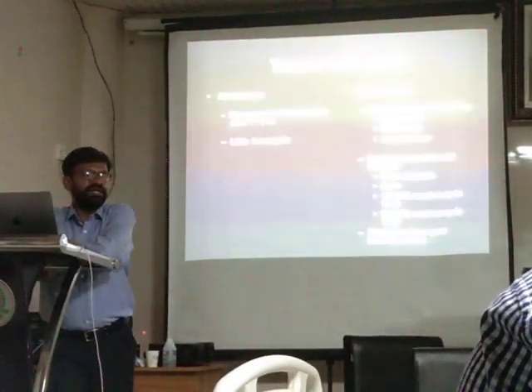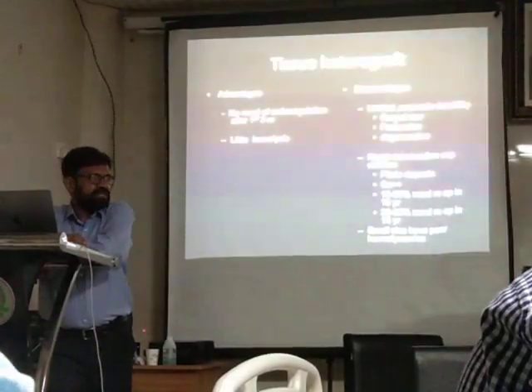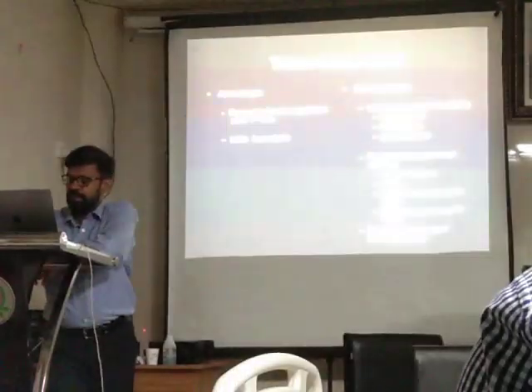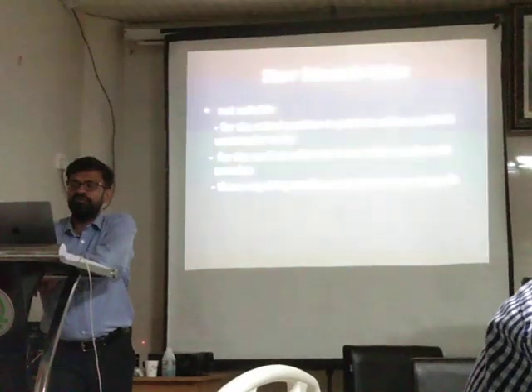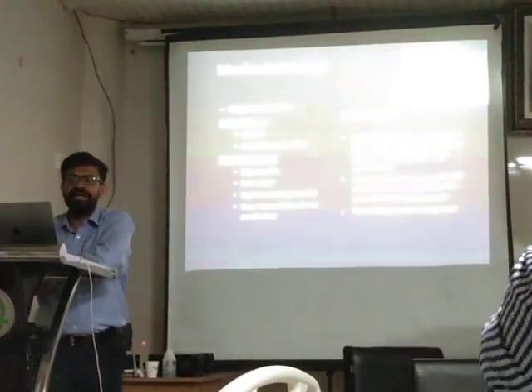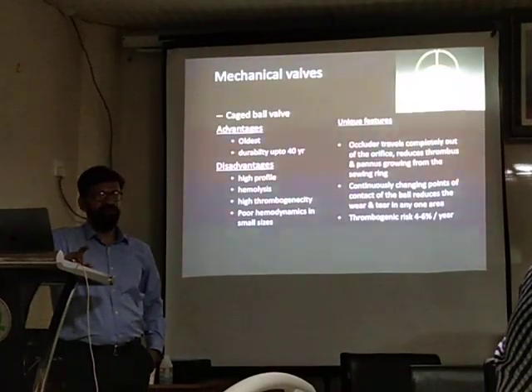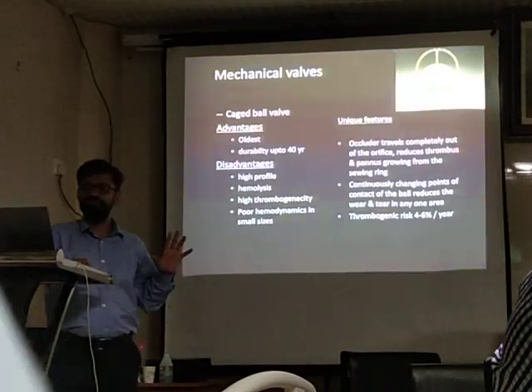If you have metallic, you need lifelong anticoagulation. If you have bioprosthetic, you need anticoagulation for only 3 months and then stop. Right? So, let's understand the first, the caged ball valve. Caged ball valve, known as Starr-Edwards.